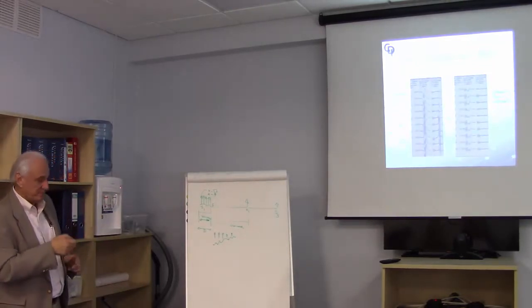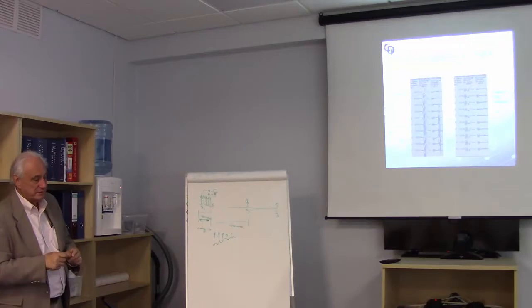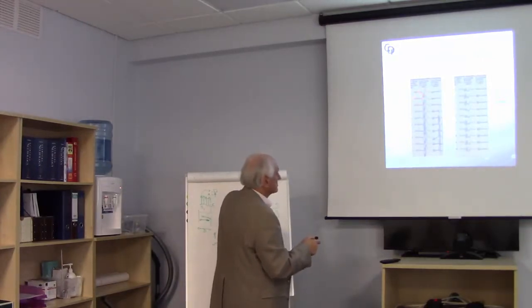This is an example of the effect of isoflurane on transcranial motor potential. So we've talked about what this is. This is an upper extremity response. This is a lower extremity response. Here's our little bursting pattern. You can see it at the beginning. These were done a second apart.